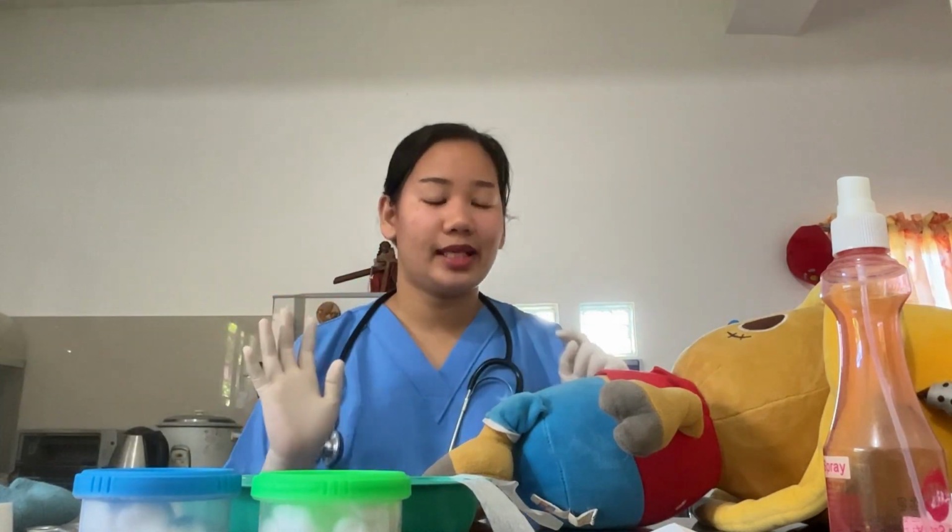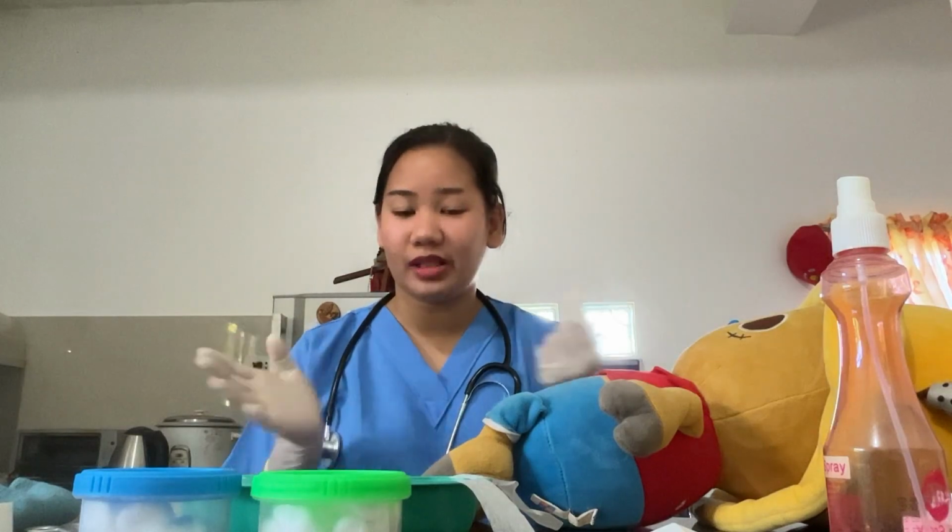Okay, so I was able to verify her identity. Then now I will determine the type and size of tube to be inserted. And after that, I will gather all the equipment that we need. And then I will now perform hand hygiene.